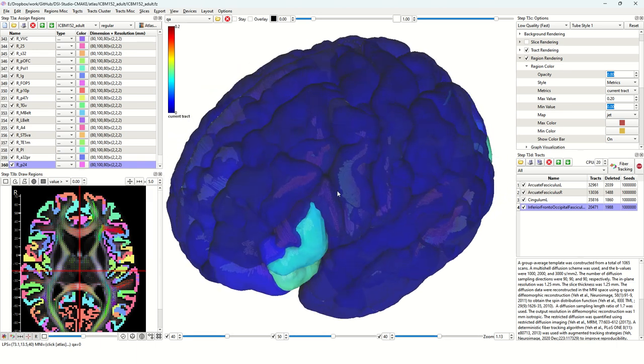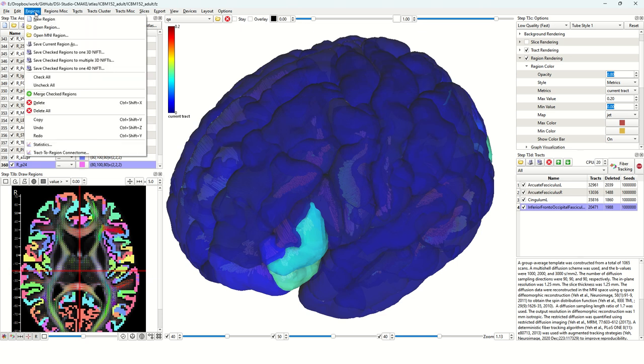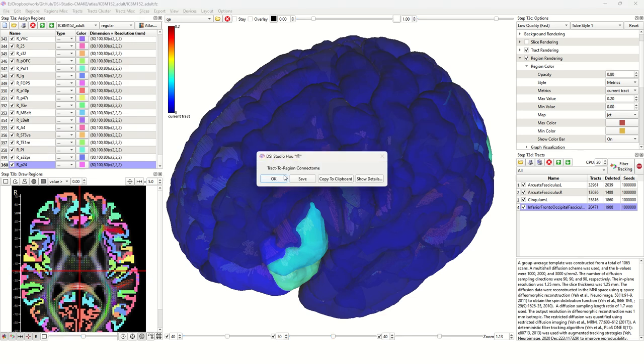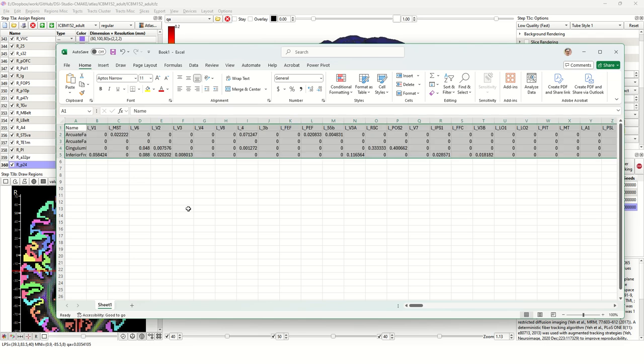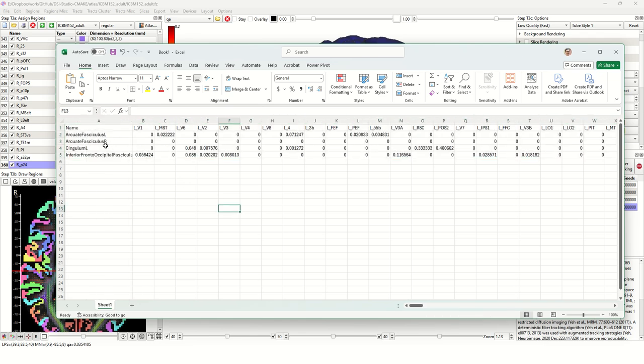In addition to visualization, if you want to get the exact values, the function will be under region. There will be a new item called tract-to-region connectome. Once you have a list of regions on the left and a list of tracks on the right, you can use this function. Once you get it, you can copy the result to a clipboard. Usually I would paste the result into an Excel sheet. You can see it will be an N by M matrix. The rows will be each of the tracks and the columns will be each of the regions, presenting the values.